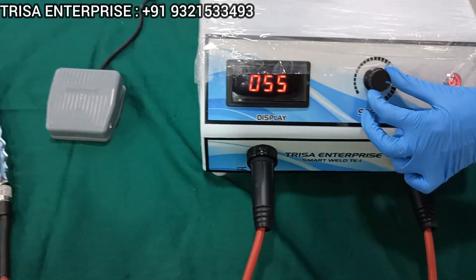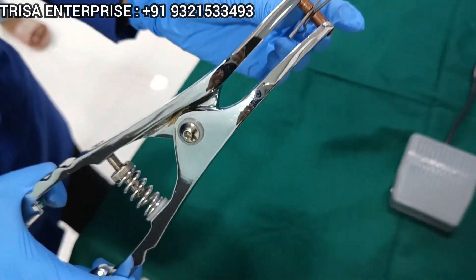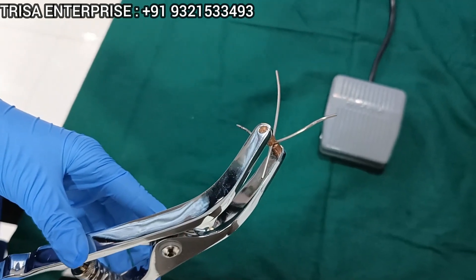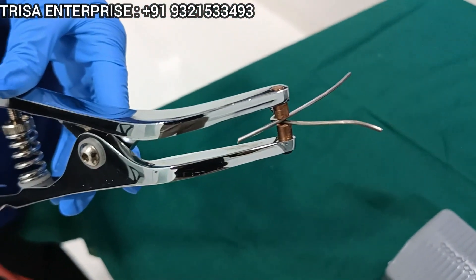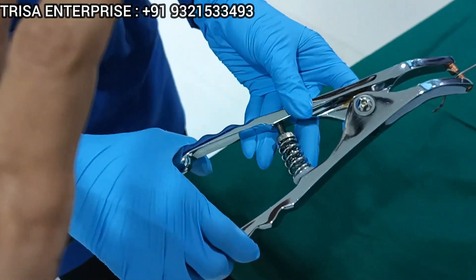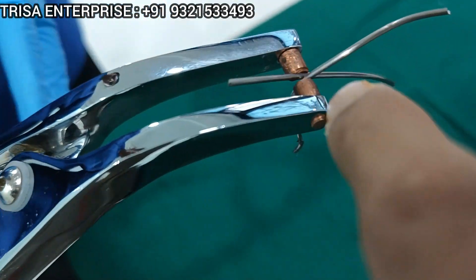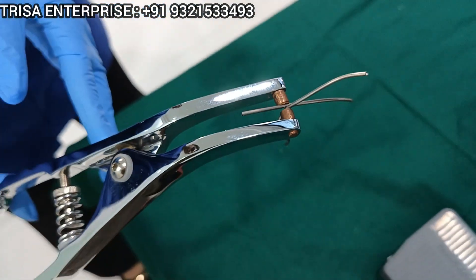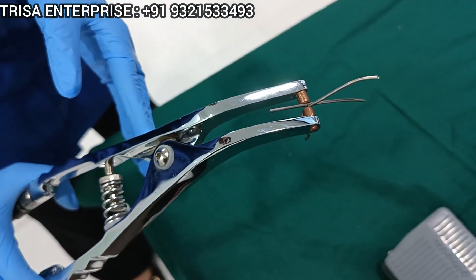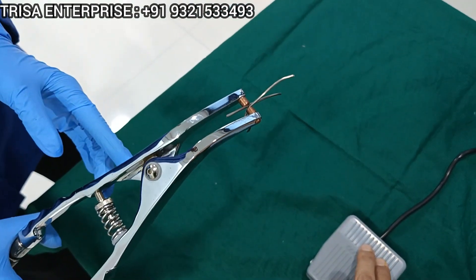Now this plier is ready to weld the wire. To weld, what you need to do is hold your wire or your implant and the wire securely between the two pliers. Make sure your hand is completely released — only then the clamps will correlate nicely. When you are ready, your assistant will spray the water and suction it out, and just by pressing the foot control, you can weld.